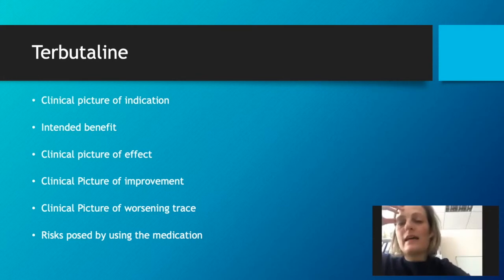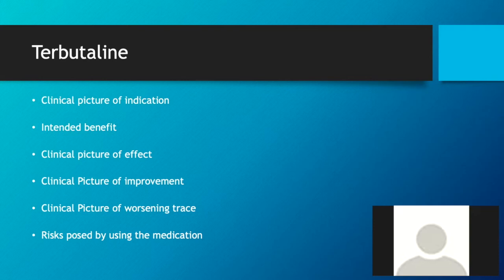Someone coming in the antenatal period, lots of contractions, distressed or not, the CTG with this uterine irritability, the two things to think about are infection and blood. Remember that a simple UTI can cause lots of uterine irritability. Usually the babies are completely well. You have a normal CTG, but a mum in pain and lots of contractions. And abruption, you can have abruption without external bleeding. How do you call that? Concealed abruption. Concealed abruption, yeah.